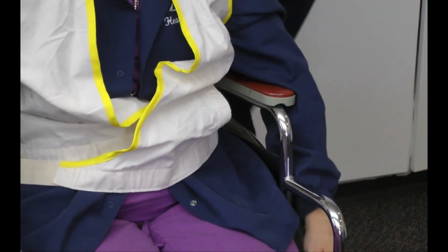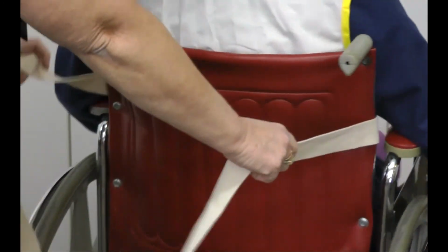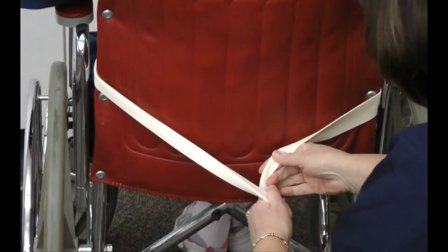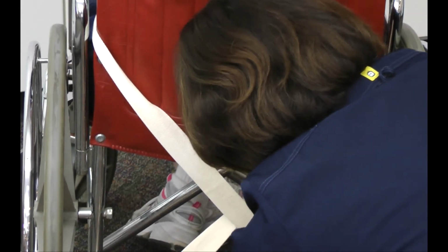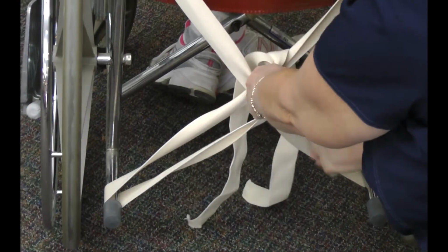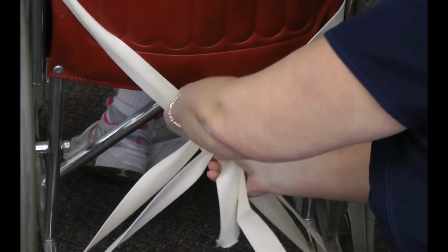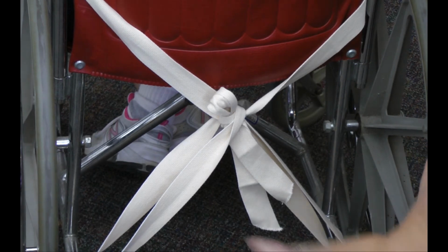Again, I'm going to turn this chair around so you can see how it comes through the back here. It's not too tight, is it, Melissa? No. Okay. I'm going to cross it on the support of the wheelchair. Bring it back up again. Flip it over. Making a slip knot. These strings are a little bit longer, so it's going to be easier to see. Pulling it up. There we go. Okay, that's a slip knot.